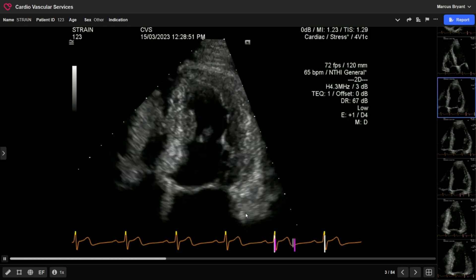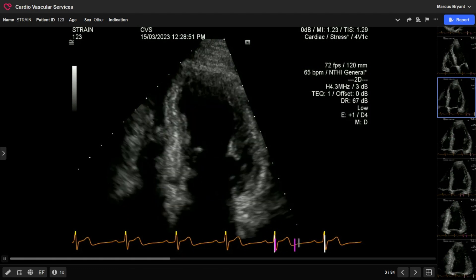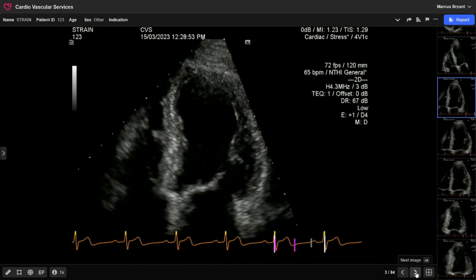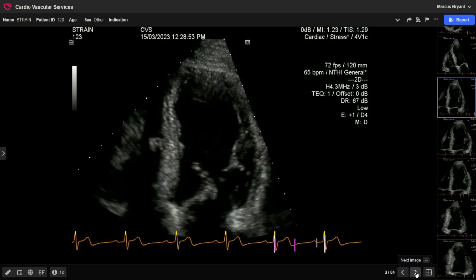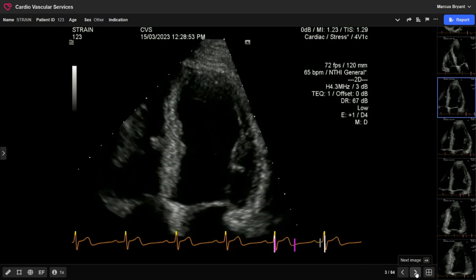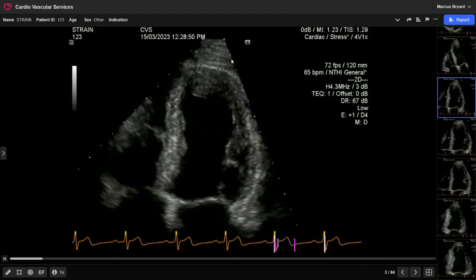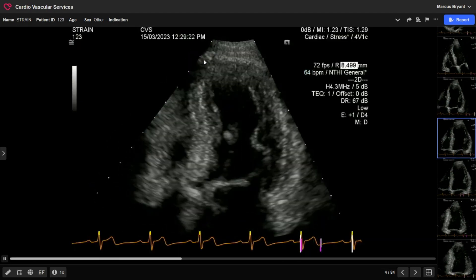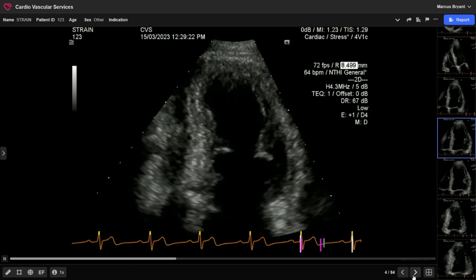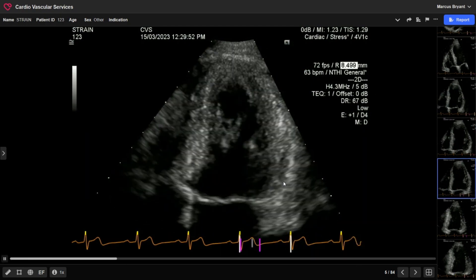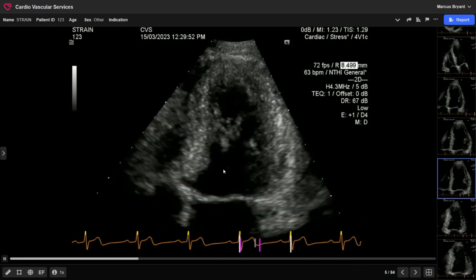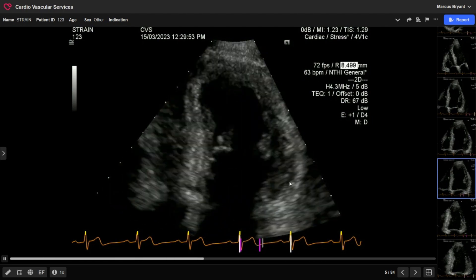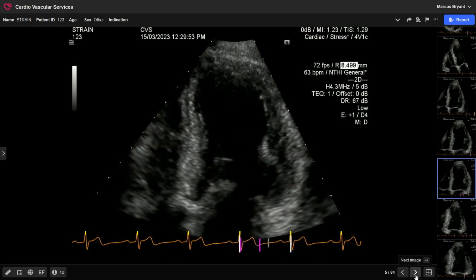What I'll sometimes do is zoom in on the image to make it a bit larger, particularly if the heart is quite deep. In this next view it's actually zoomed up on the left ventricle, and I've also got a second one here. If possible I'll try and get a view without too much interference from papillary muscles, but that's not always possible.